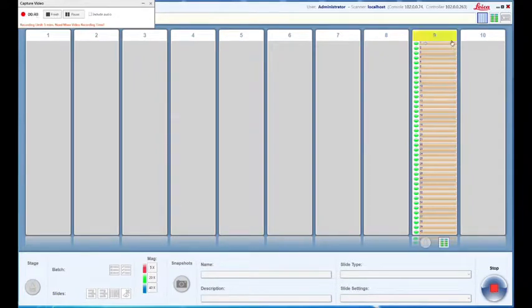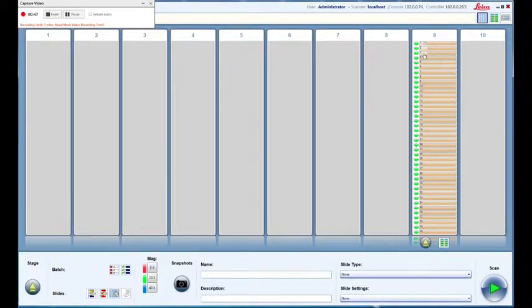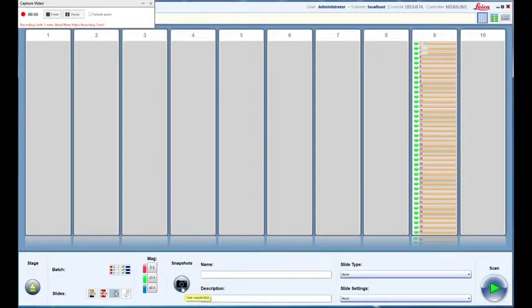Everything should appear orange. To select the slides that you just loaded, you're going to click on the top, shift, and then your last slide. The first three right there are going to be the slides for this run.